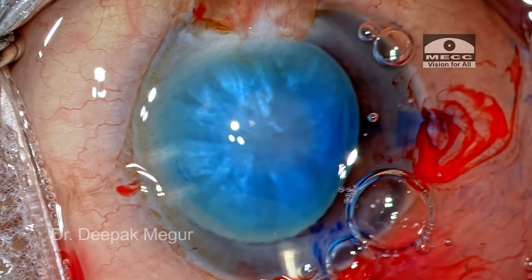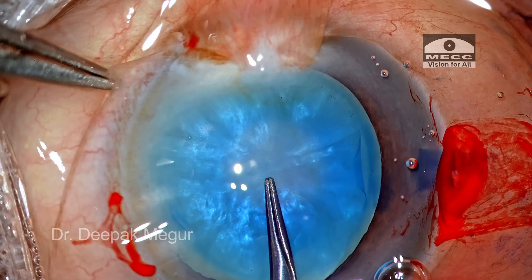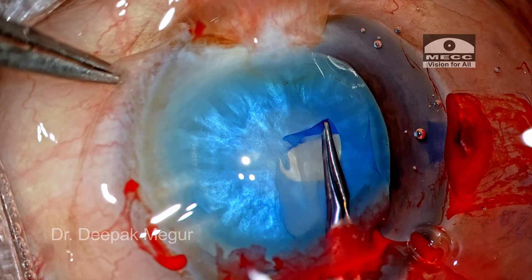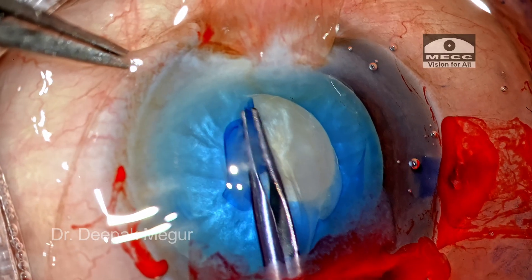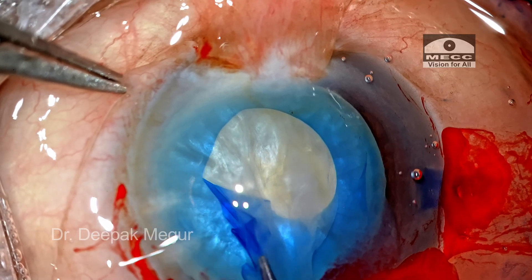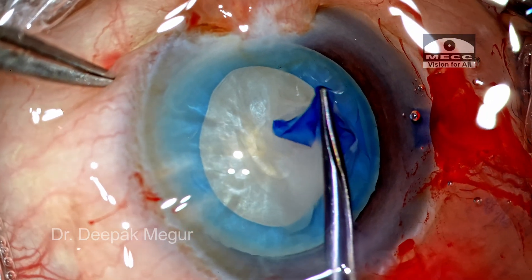Time to perform the capsulorhexis. The rhexis is a very critical step in this eye simply because we expect it to run out. The moment I puncture the capsule and lift the flap, I can see some of the liquefied cortex just burping out. This is a good sign — it indicates that the intralenticular pressure has decreased, as the pressure has been passively released by the egress of this liquefied cortex. So the capsule is folded and I'm continuing the shearing method as I feel very much in control.